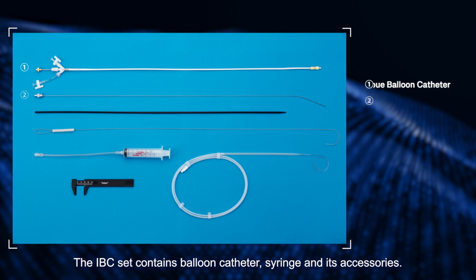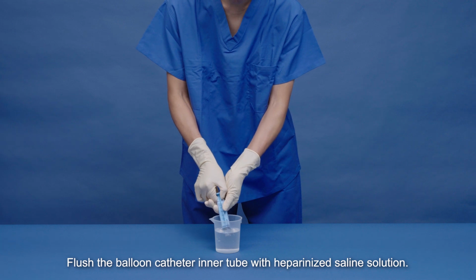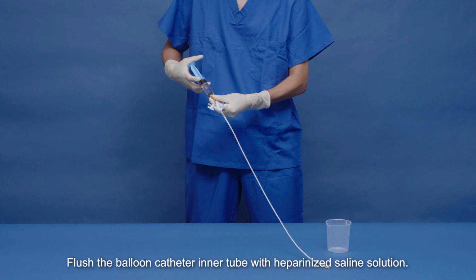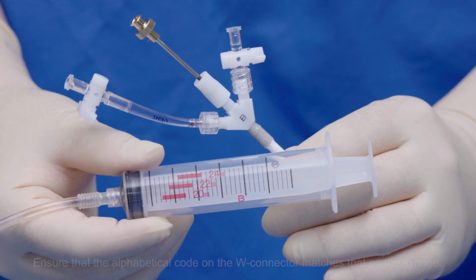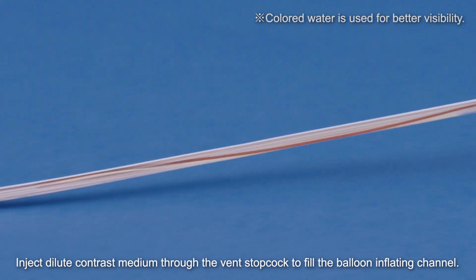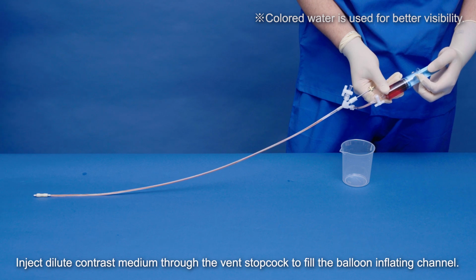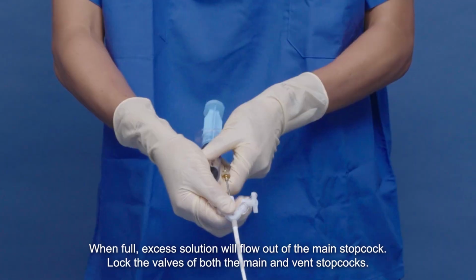The IBC set contains the balloon catheter, syringe, and its accessories. Flush the balloon catheter inner tube with heparinized saline solution. Ensure that the alphabetical code on the W connector matches that on the syringe. Inject dilute contrast medium through the vent stopcock to fill the balloon inflating channel. When full, excess solution will flow out of the main stopcock.